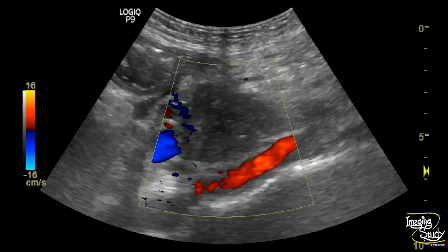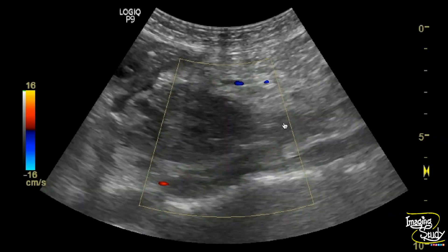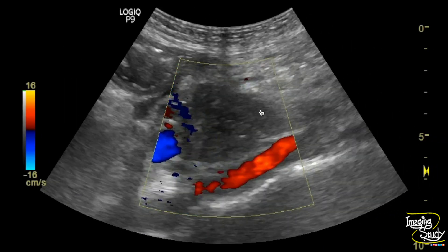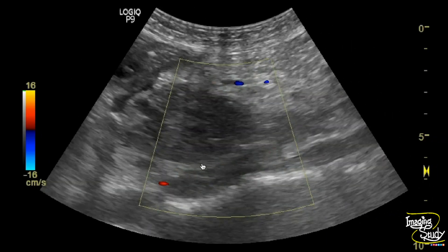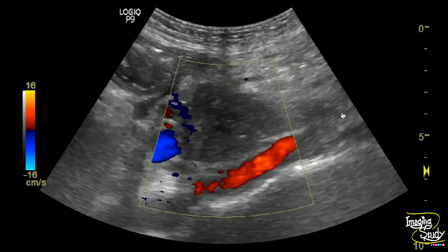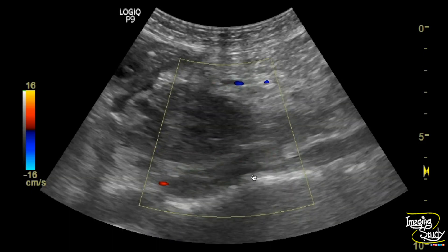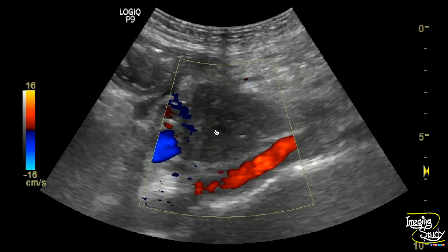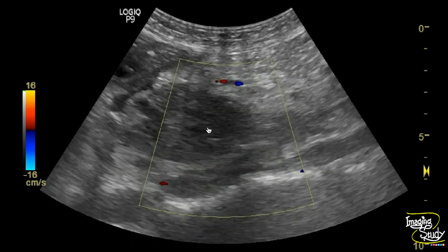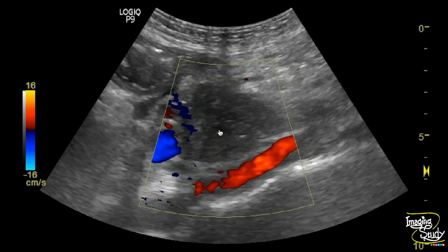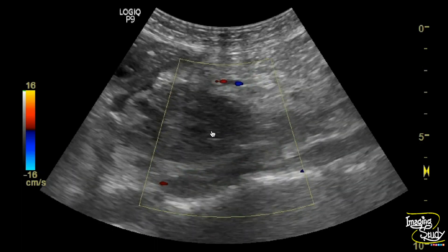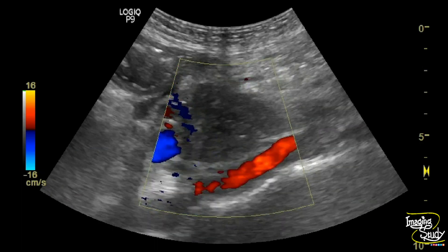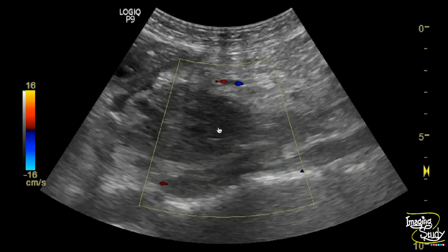Here is the oblique longitudinal view of the lesion. You can see the part of the aorta here. If you check carefully, there are some anechoic spaces at the center of the lesion — these anechoic spaces represent the necrosed part within the tumor.